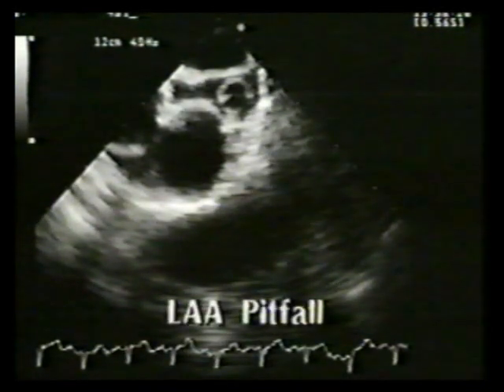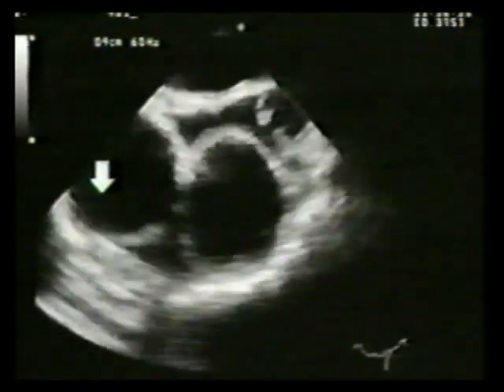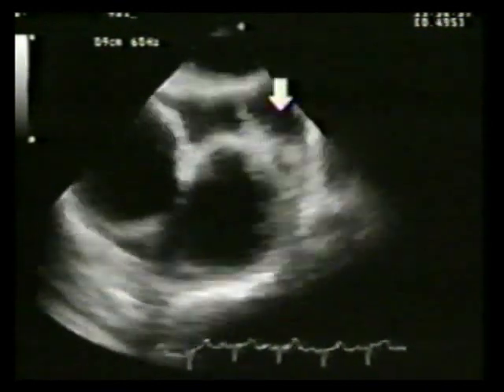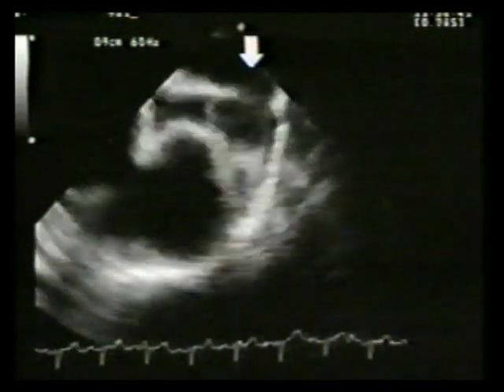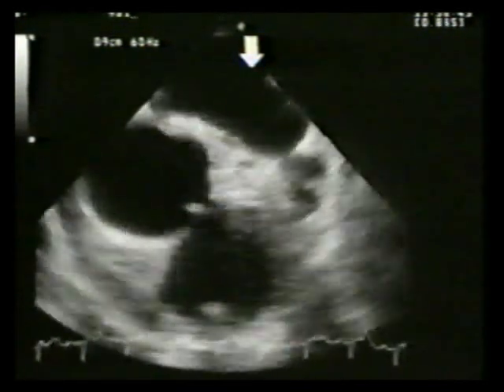This segment illustrates a potential pitfall. Posterior to the pulmonary artery and aorta is the transverse sinus, a pericardial reflection. Occasionally, the tip of the atrial appendage appears as a tumor-like structure or ovoid structure. This is actually the normal left atrial appendage caught in short axis within the transverse sinus.